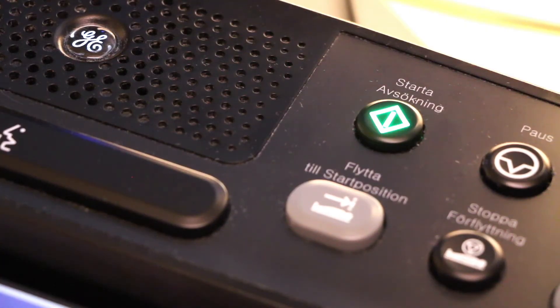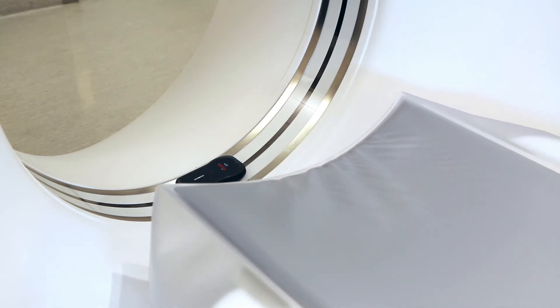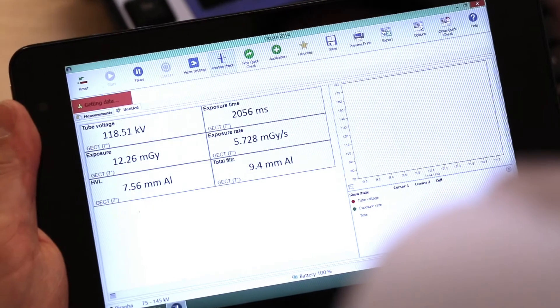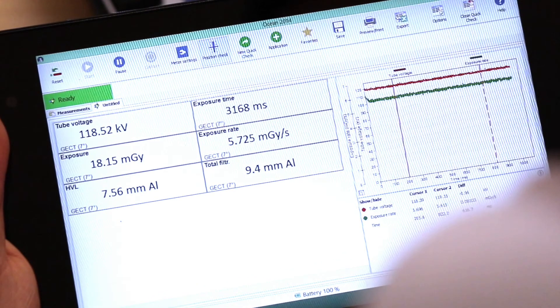Now you are ready to start your kilovolt measurements by performing a topogram scout with a suitable kilovolt you want to test. As you can see, you get all your values instantly, including waveforms and analyses.